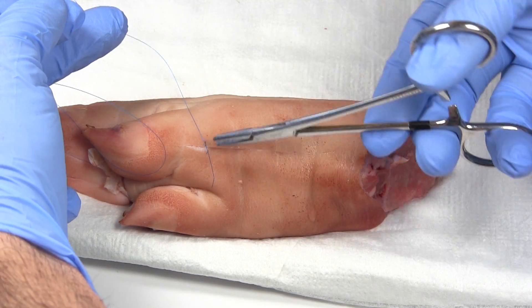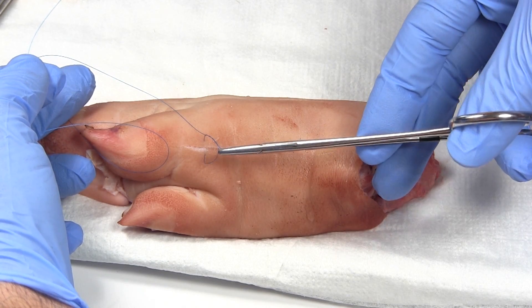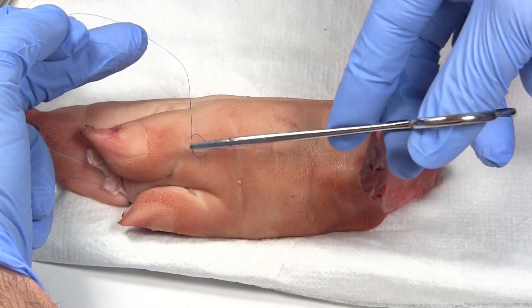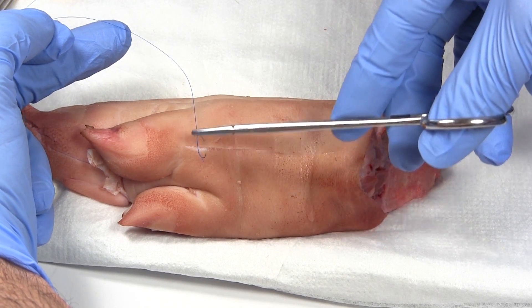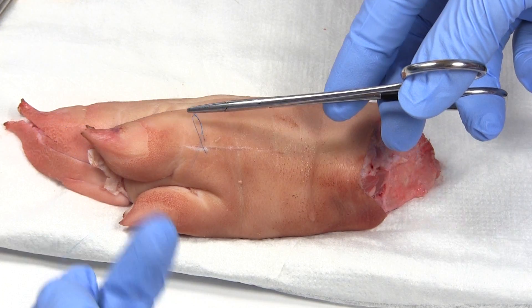Tighten it down — as you're tightening, you want a nice straight, flat knot. Sometimes depending on the angle you can get a crooked knot that won't sit flat. You want a nice flat, even knot — cinch it down. It doesn't have to be super tight; you just need to get the skin edges together and the body will take care of the rest.